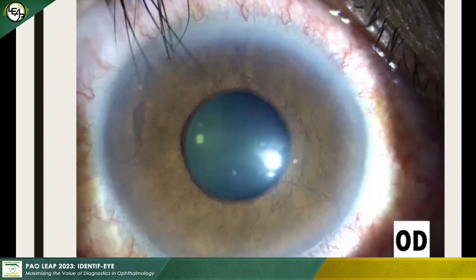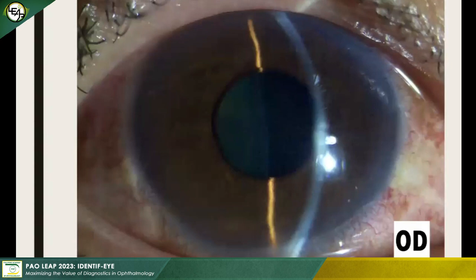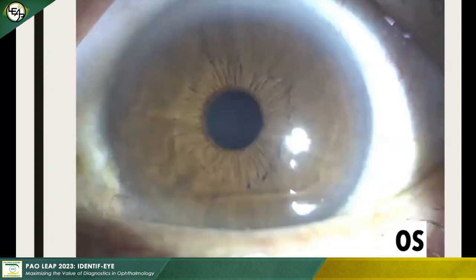So this is the slit lamp image of the right eye. Notice the mid-dilated pupil and the dense neovascularizations on the iris surface characterized by a haphazard course. The chamber remains deep, and one would think, if you didn't perform any gonioscopy, oh, it's deep. It probably might be open.